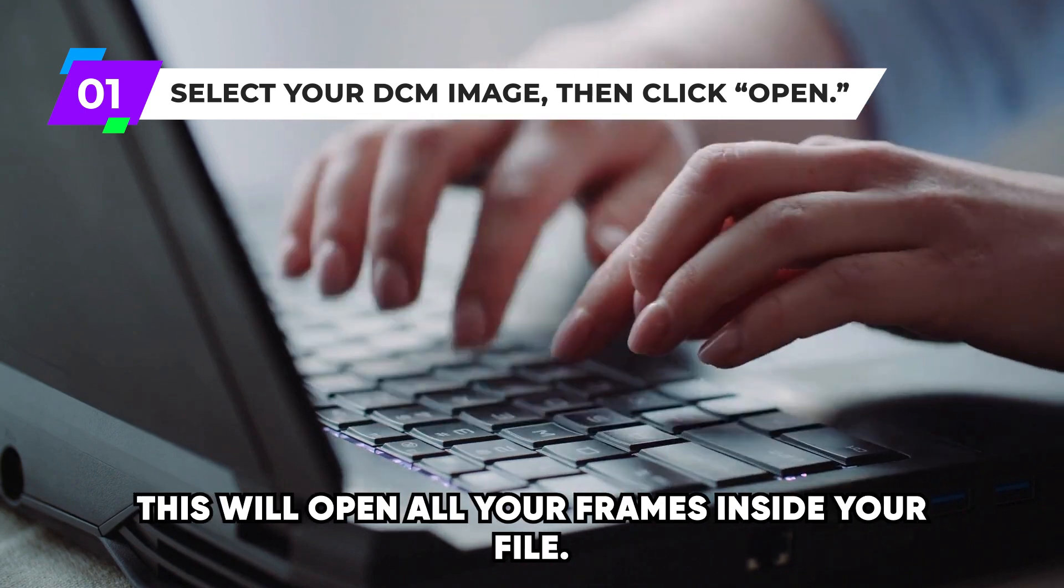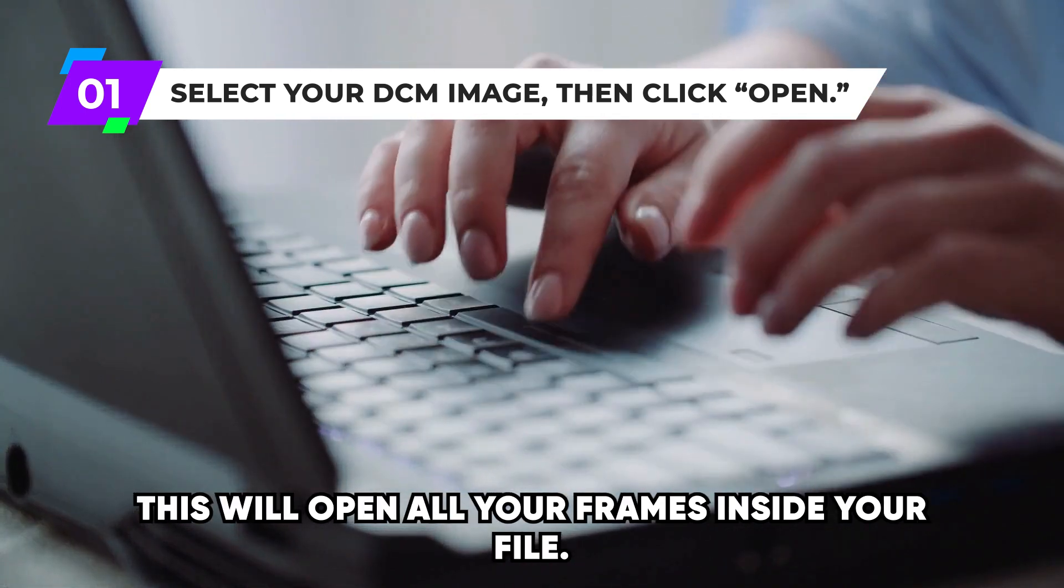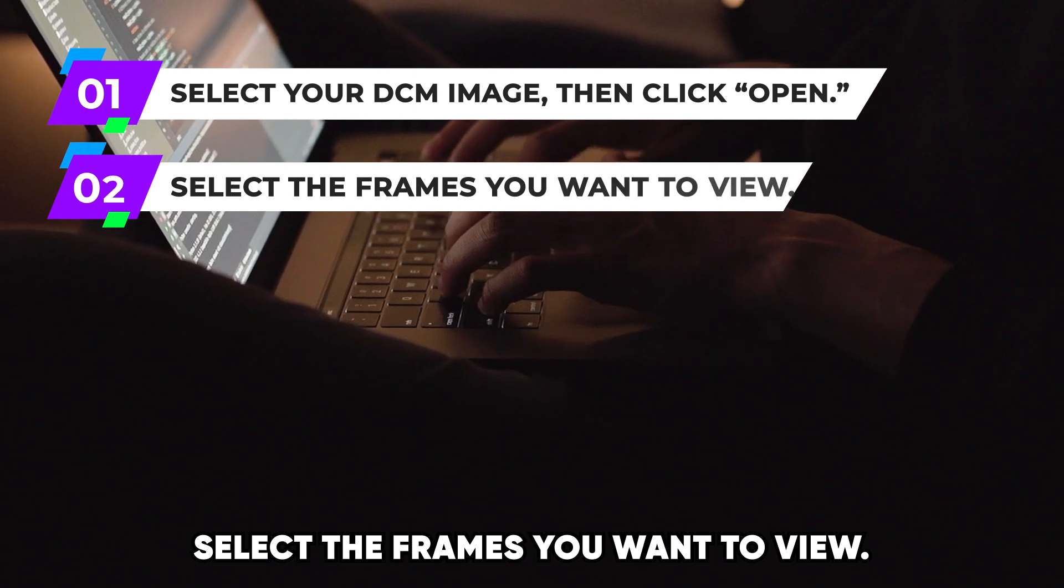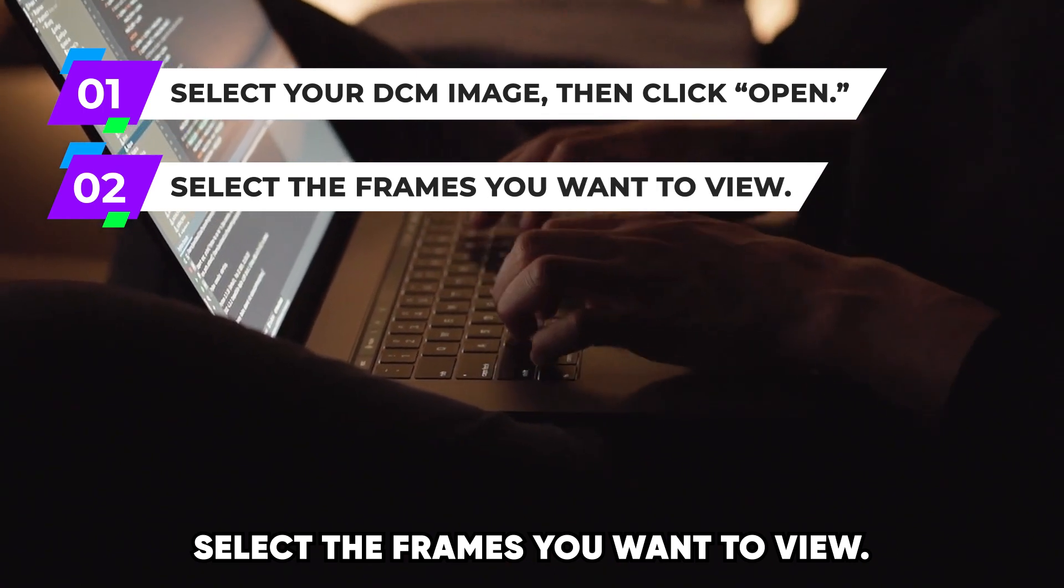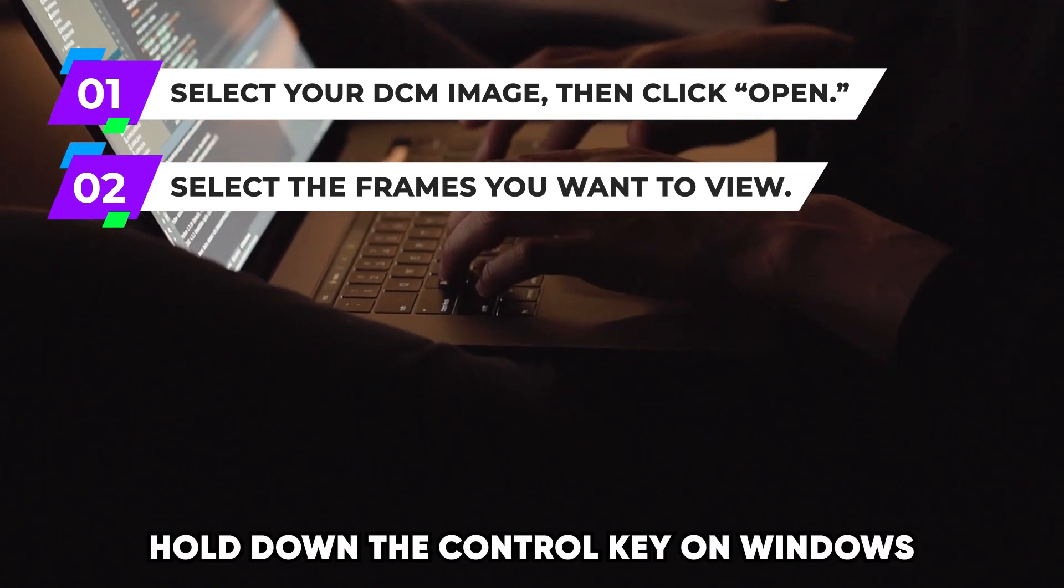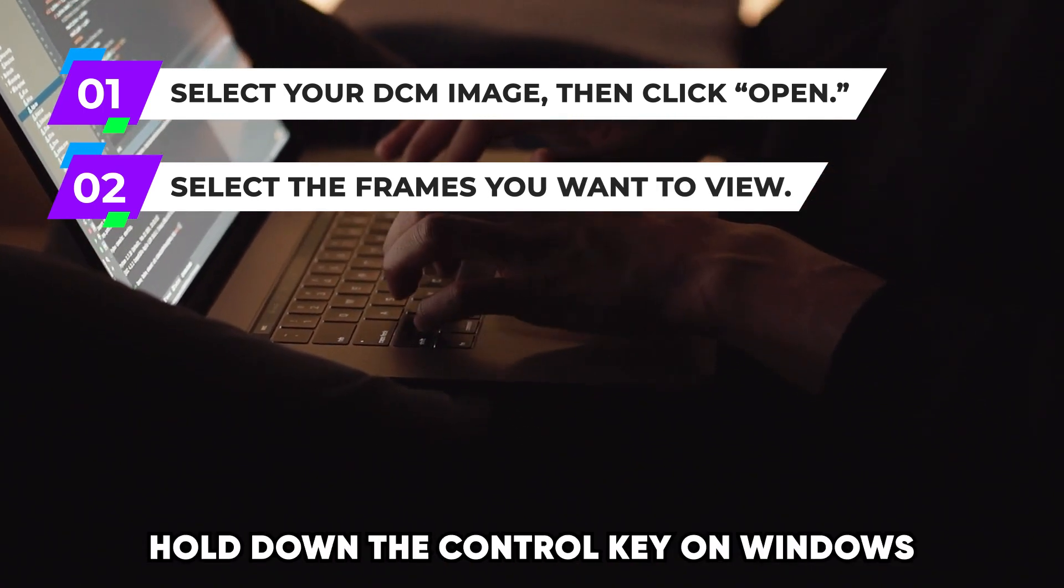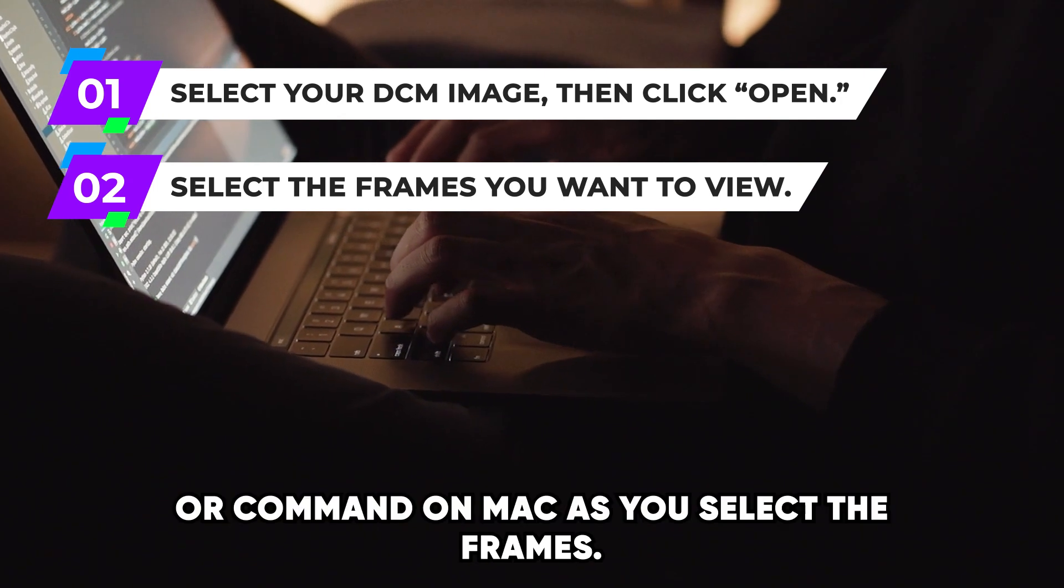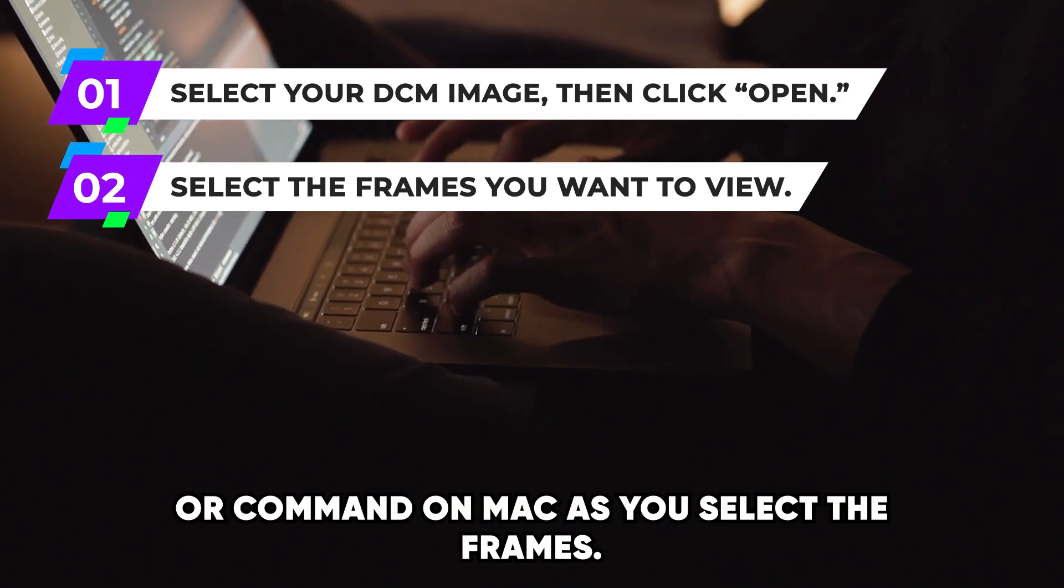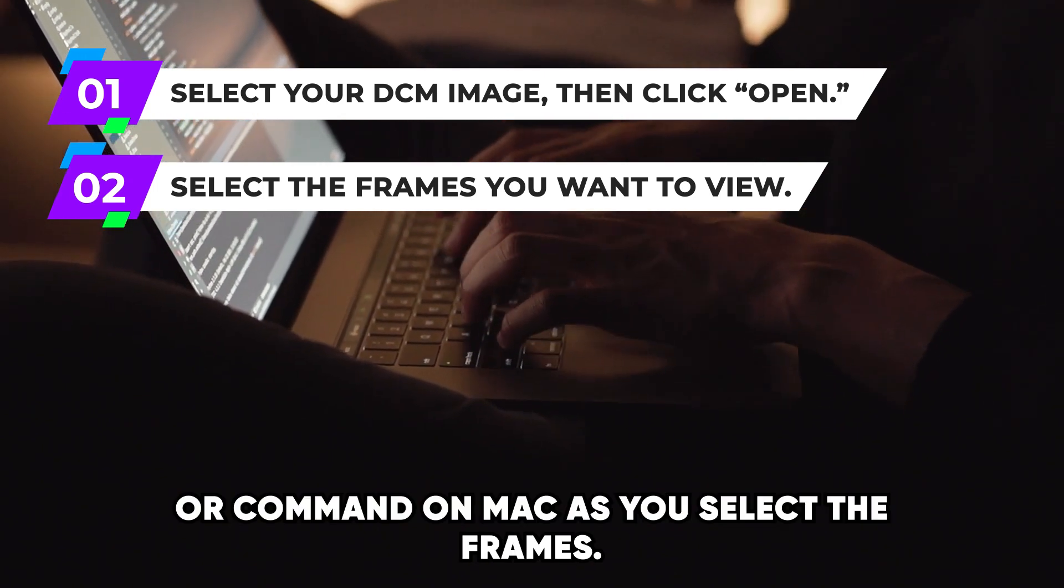Doing this will open all your frames inside your file. Select the frames you want to view. To view multiple frames, hold down the Ctrl key on Windows or Command on Mac as you select the frames.